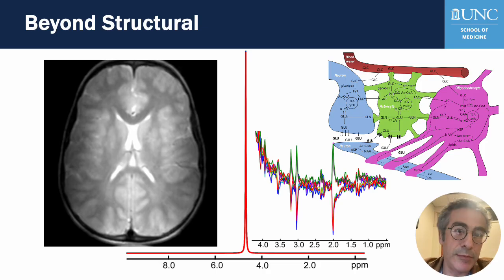We all know that MRI consists of hydrogen atoms that are attached to the water. Also, if we come up with an idea to get rid of the water molecules, we can see the other molecules, like in spectroscopic acquisition: NAA, creatine, choline. Each individual metabolite is significantly related to certain markers. So it is important to know that having a signal attached to the hydrogen atoms is important.